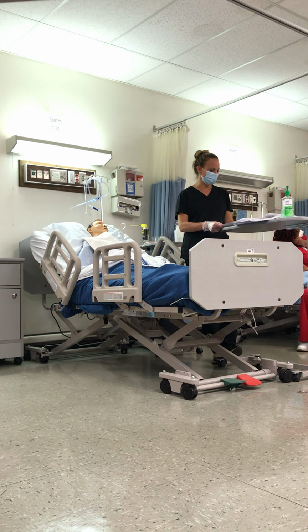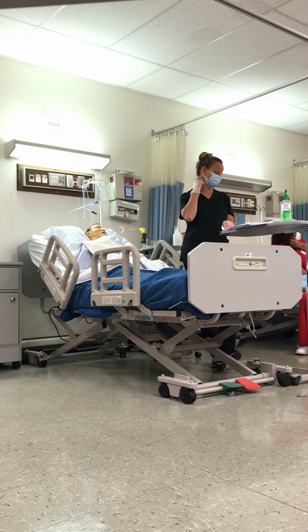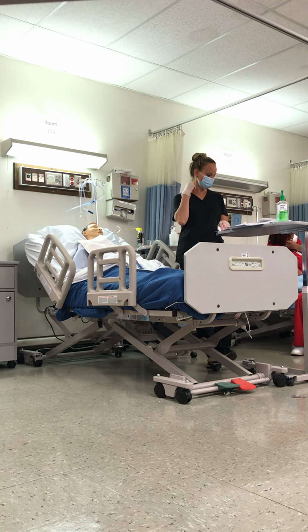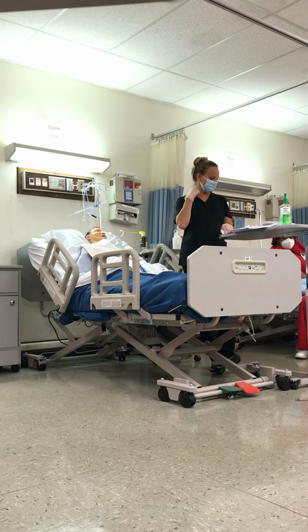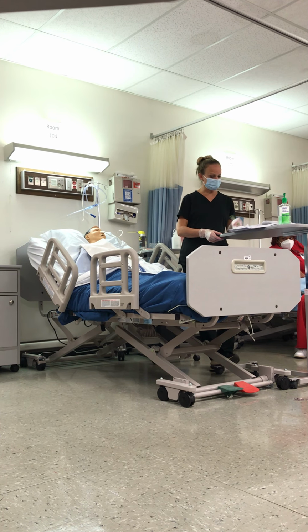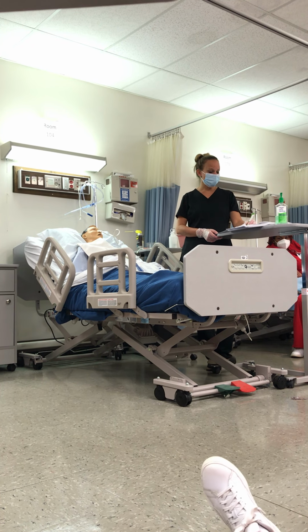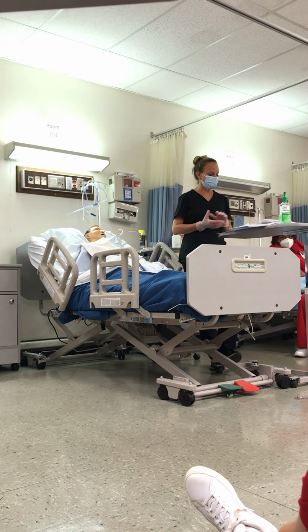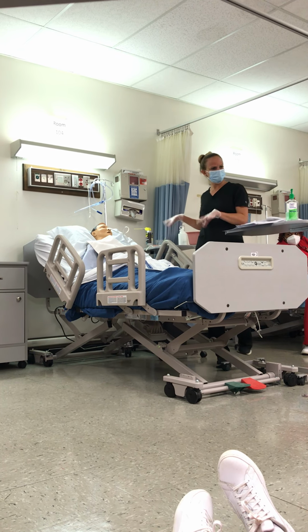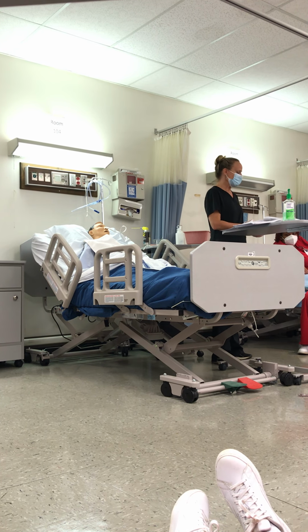It says if their findings are inconclusive, consult with the physician. A lot of the nurses that I've talked to say they don't get X-rays. I think it has to do with the type of tube and the doctor probably who's ordering it. So it says proceed to secure the tube. We've already done that, but then that would be securing it to the bed, okay? We would then properly document, but what would we do really before we properly documented? We clean all of our stuff up and wash our hands, use hand sanitizer, right?